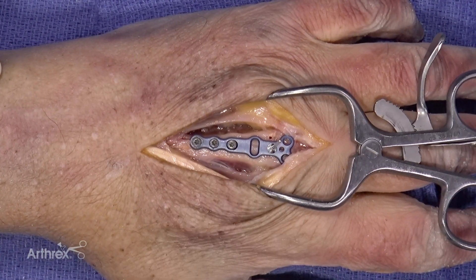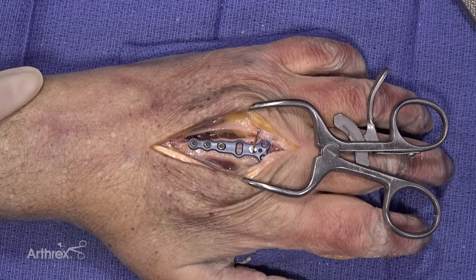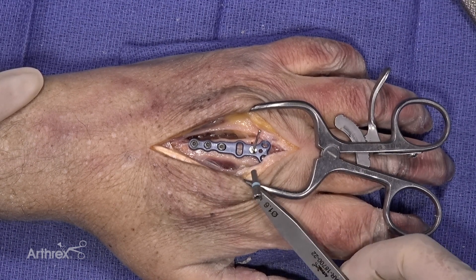At this point in time, it is not necessary to take these screws all the way down to their maximum bite, as we are going to remove the plate prior to making the osteotomy. The next screw to be placed prior to the osteotomy is a screw in the distal fragment — the fragment that will be on the distal side of the osteotomy — and this screw is placed into the oblong hole.